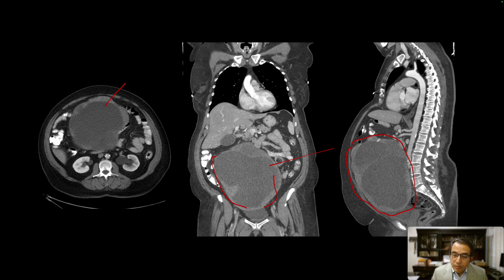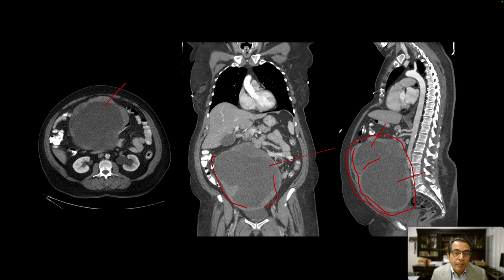It has complex features. Parts of it are cystic, there is probably a septum, and there is irregular thickening and enhancement involving the periphery. Such masses are generally ovarian tumors. They arise from one of the ovaries, left or right, and grow into the abdomen.